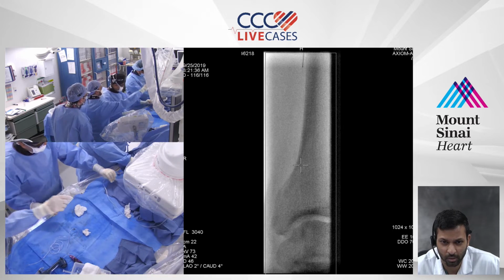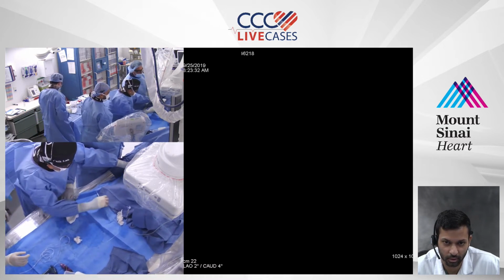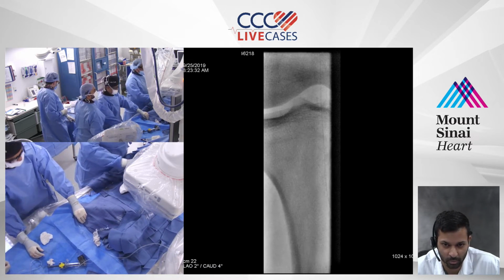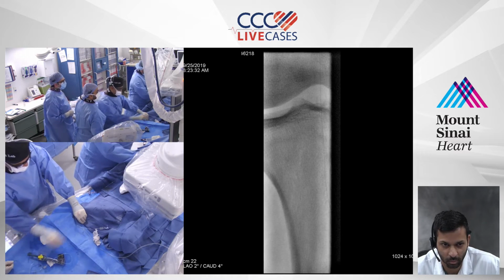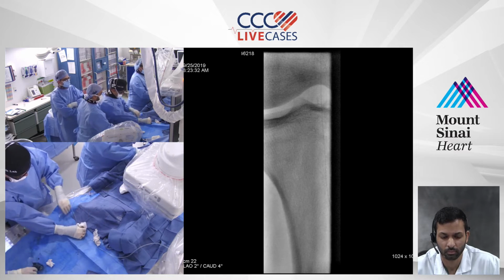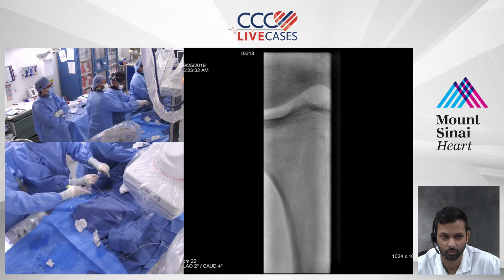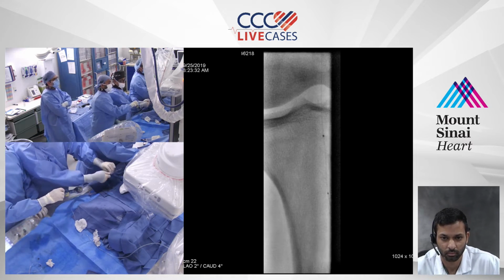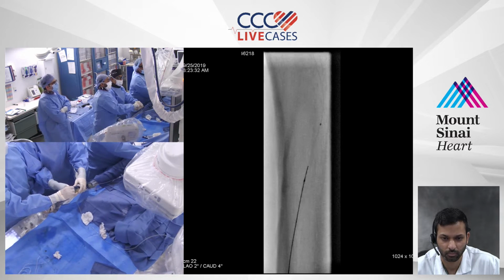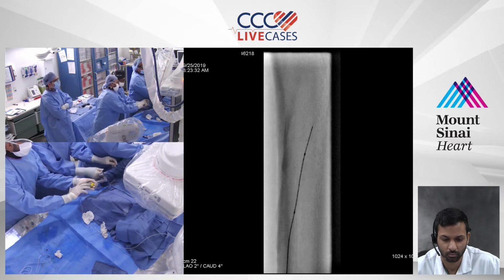Especially in someone that has one vessel runoff, and if they're claudicant for whatever reason, I would strongly consider not touching that tibial vessel. But maybe I'm just more conservative. No, I personally think you're very appropriate, like we are. Don't get me wrong, we've done pedal to cross a lesion. We never treat through the pedal primarily. That's never been our goal. It's always been let's do access and then go up and over if we have to, and then treat some other way.